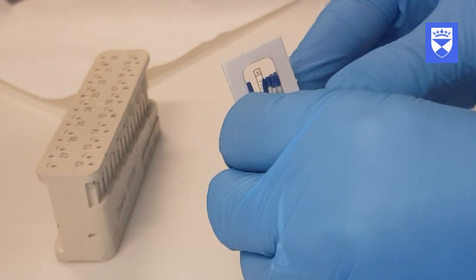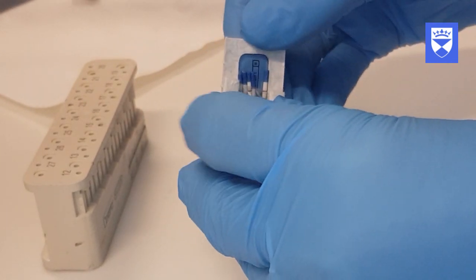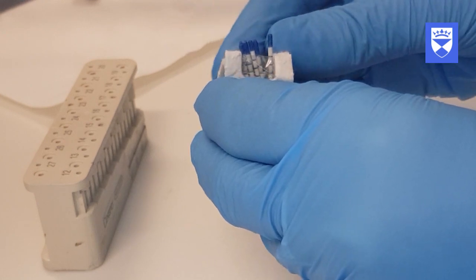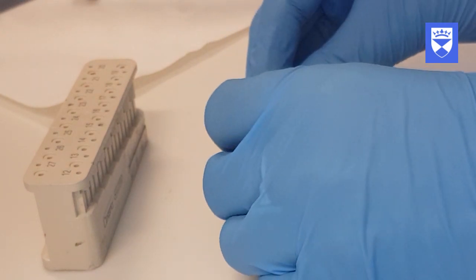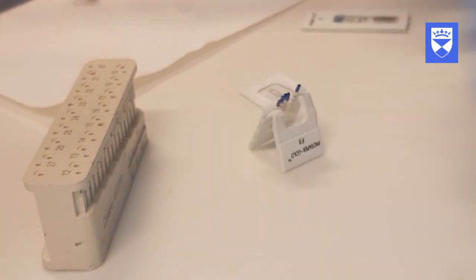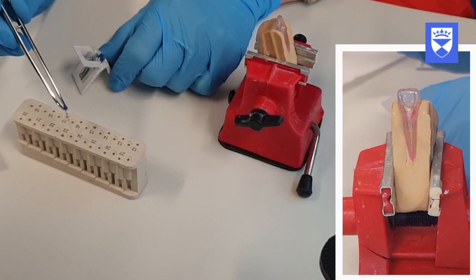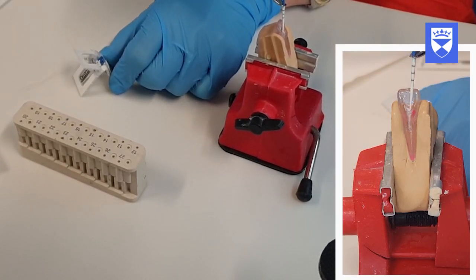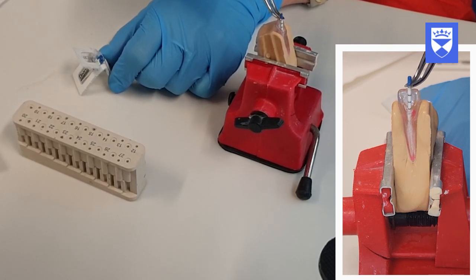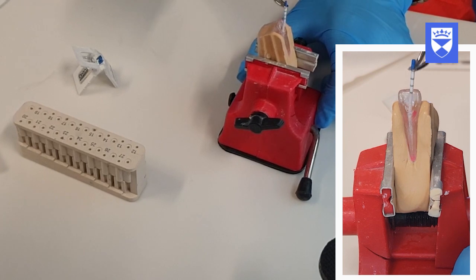Following the final irrigation, paper points equivalent to the finishing file size should be used to dry the canal. Care should be taken to maintain the sterility of the paper points when opening the packet. Measure the paper points to the working length of the canal and insert them fully to this length to dry the canal. Repeat until the paper points come out dry, indicating that the canal has been dried.